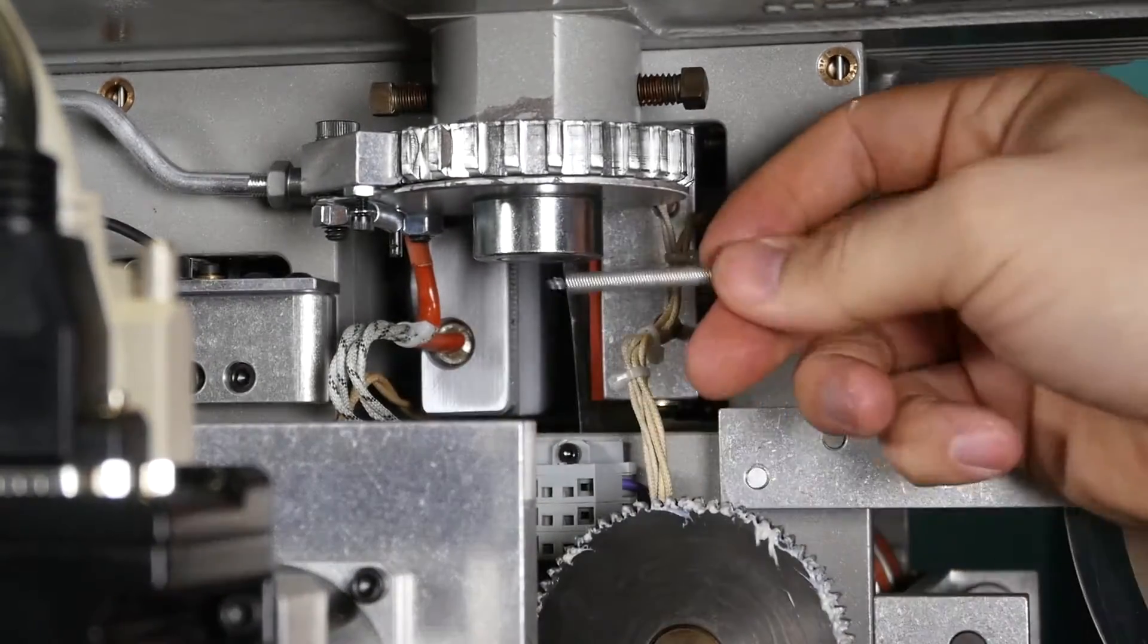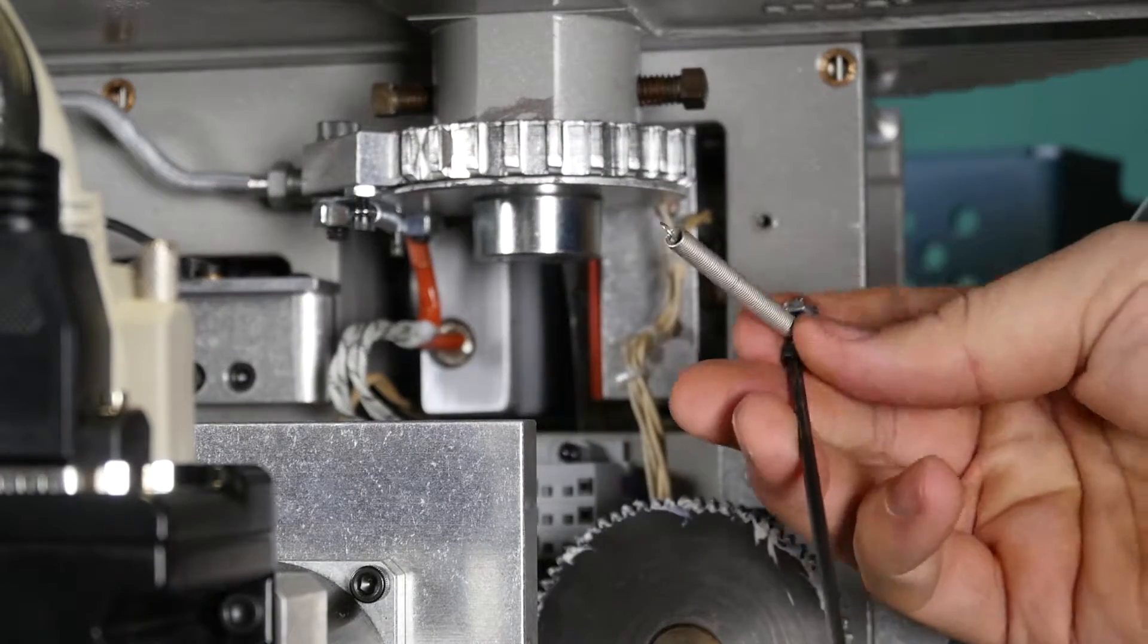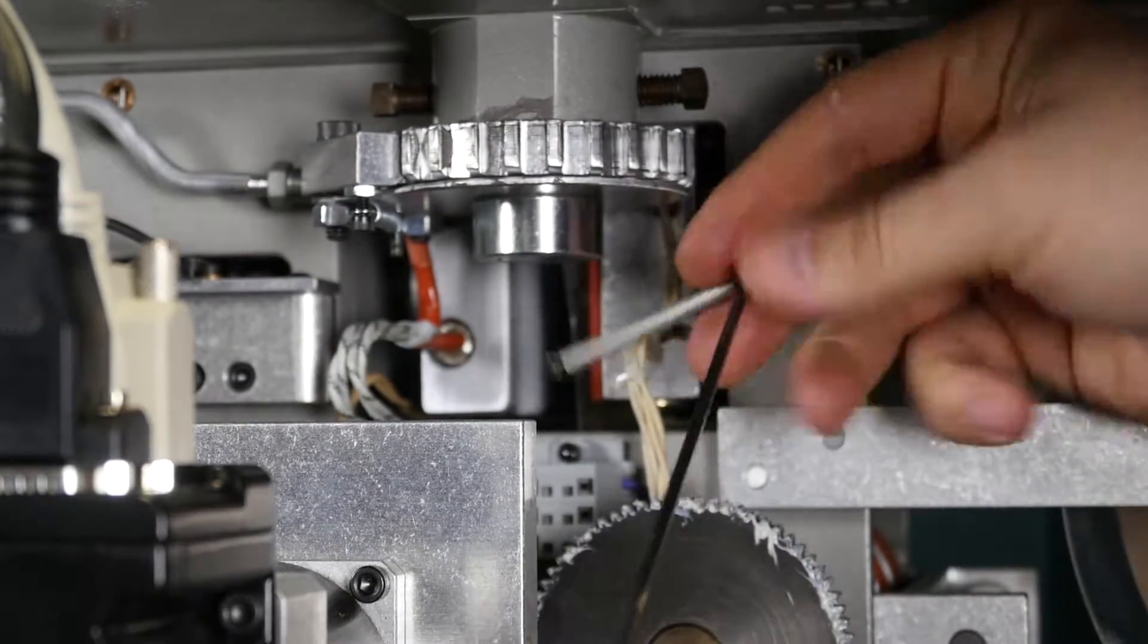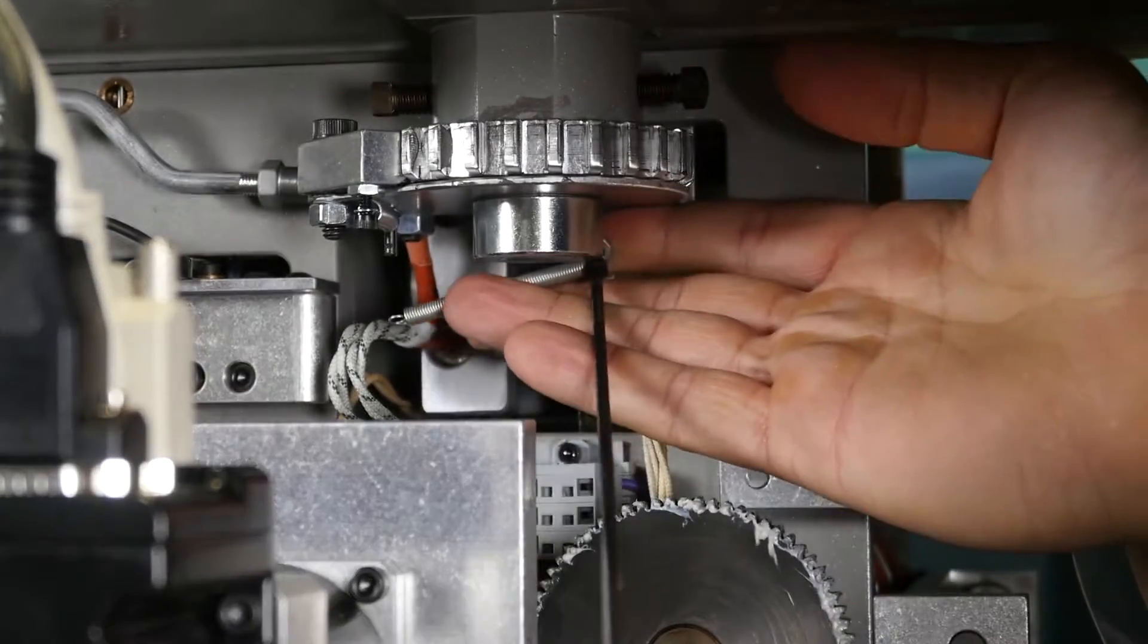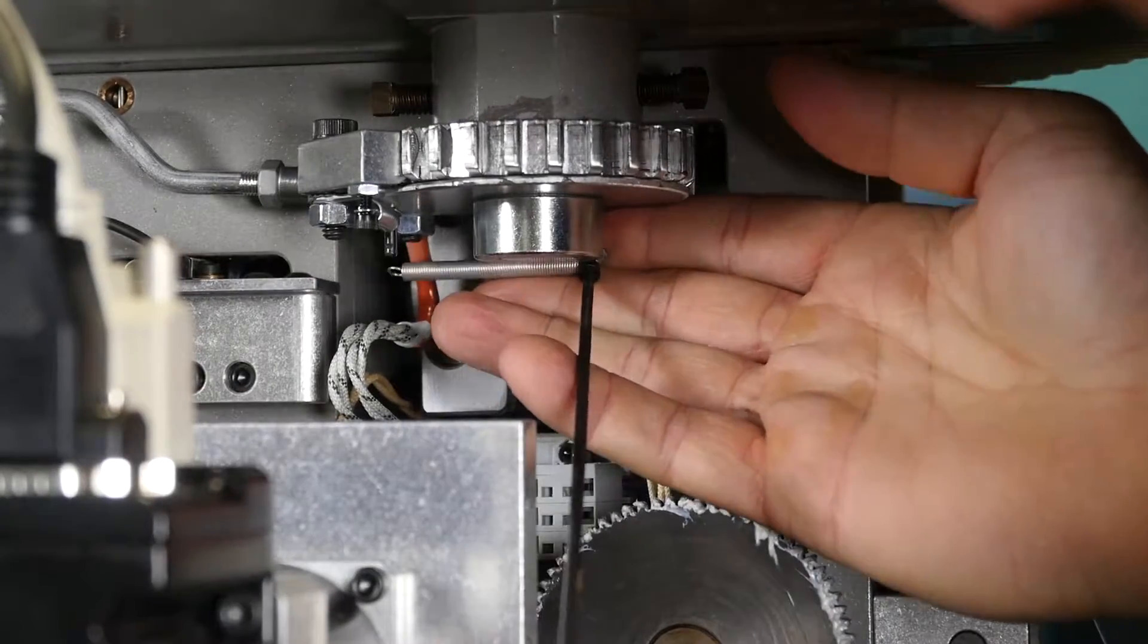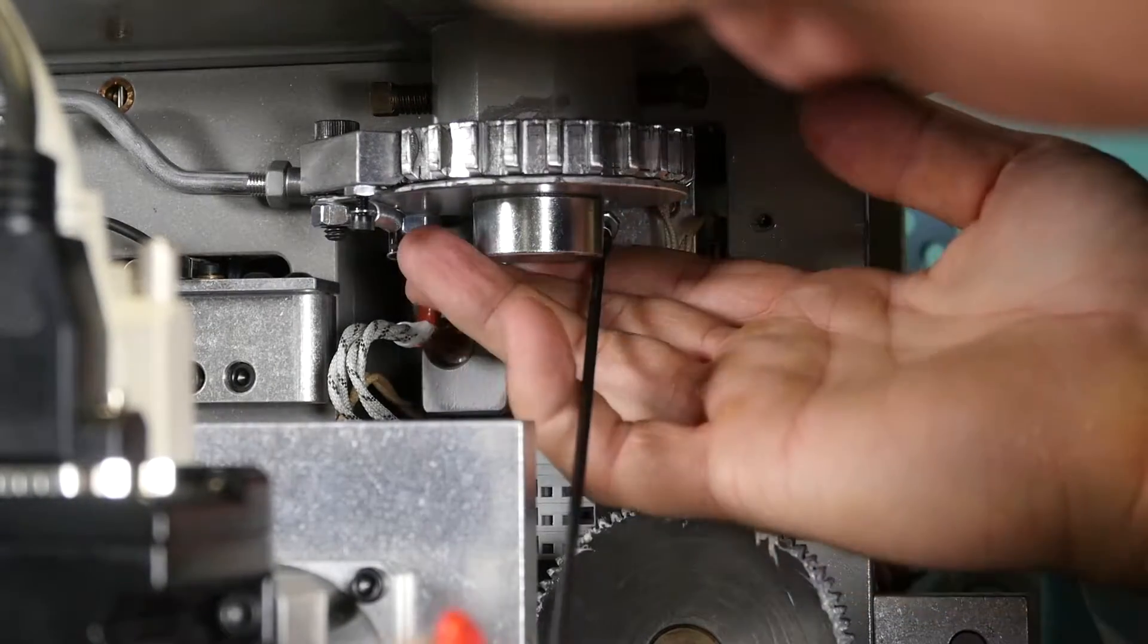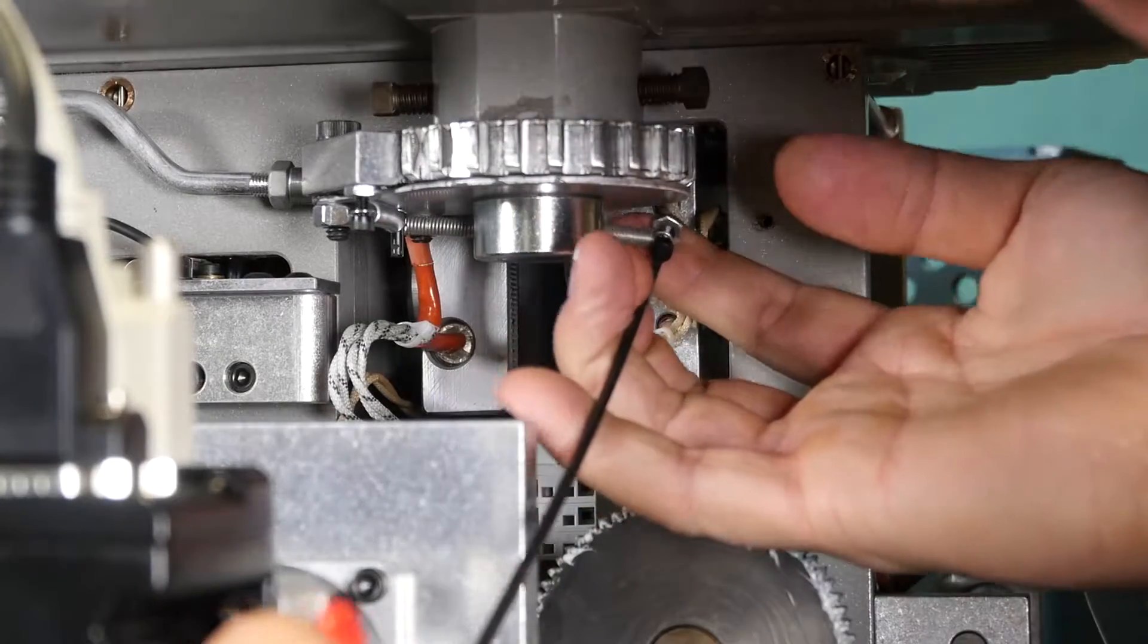Place spring on the locator pin while holding the bolt with the T-handle. Pull spring and bolt assembly behind shaft collar.